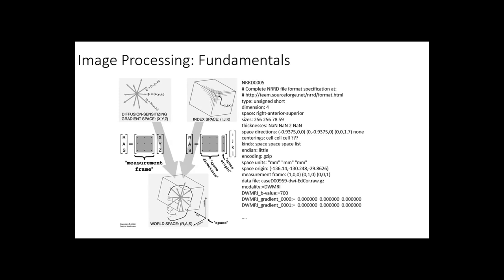All the images are basically like a cube, so the computer can store this data in a continuous memory space. This is your first pixel or first voxel in your image.